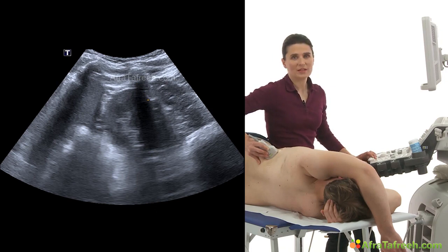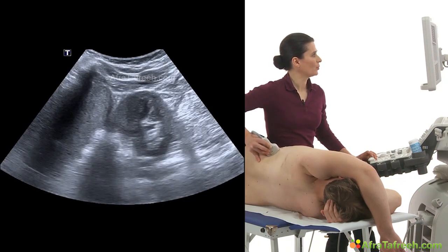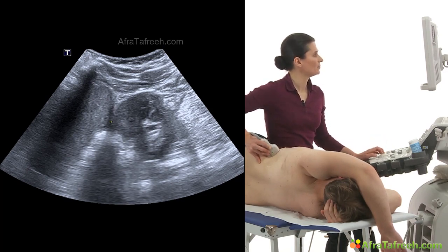So the left kidney is sometimes not so easy to scan in the transverse plane, but the patient can help us a lot. Inhale, please. So we can use the breathing movement of the patient to help us scanning the kidney. Exhale, please. Now you can see this picture is a lot better. We've got again the parenchyma and the bright hyperechoic renal pelvis in the center. Here the spleen.